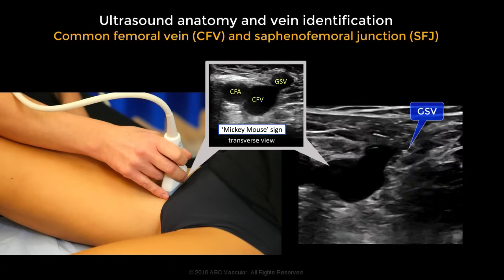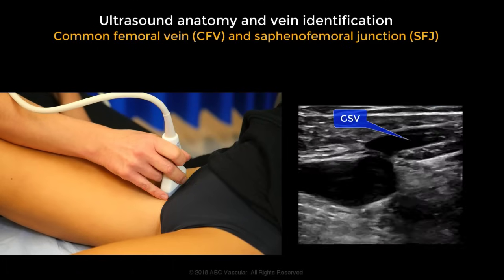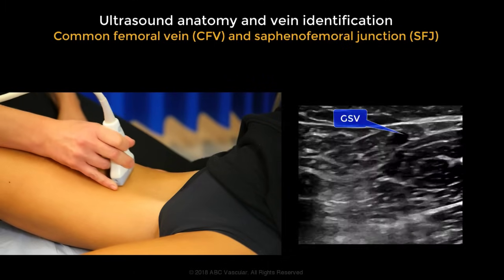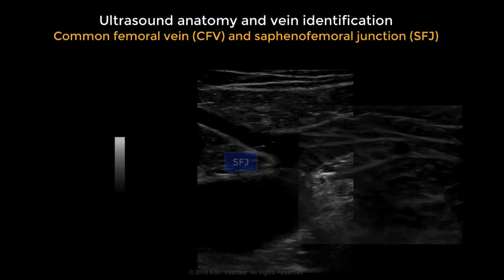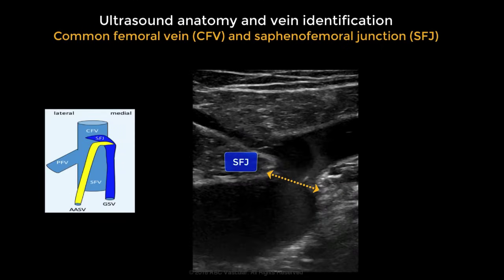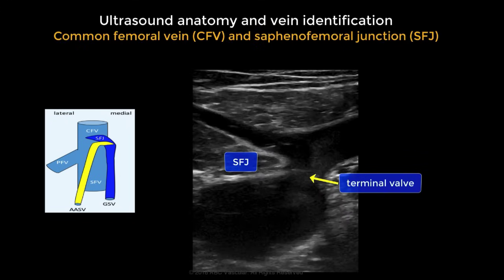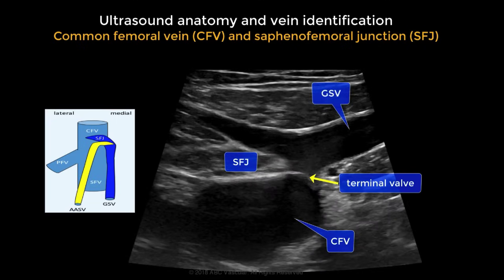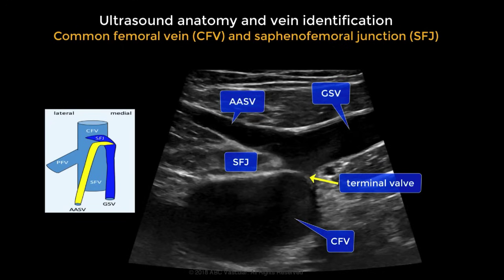This is the so-called Mickey Mouse sign and represents the saphenofemoral junction. From the common femoral vein you can see the great saphenous vein, which leaves the common femoral vein and continues in the medial aspect of the thigh. Looking carefully at the saphenofemoral junction, we can see the terminal valve, which is typically located at this level, and then the origin of the great saphenous vein and the anterior accessory saphenous vein.